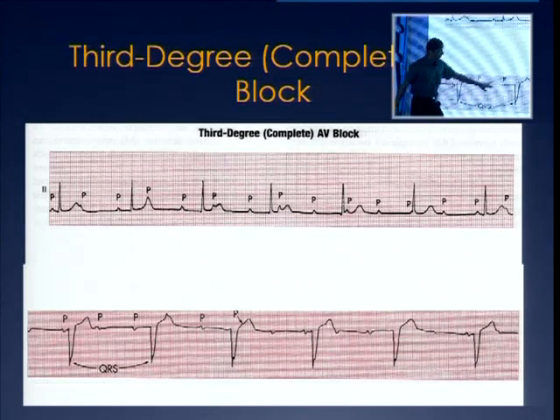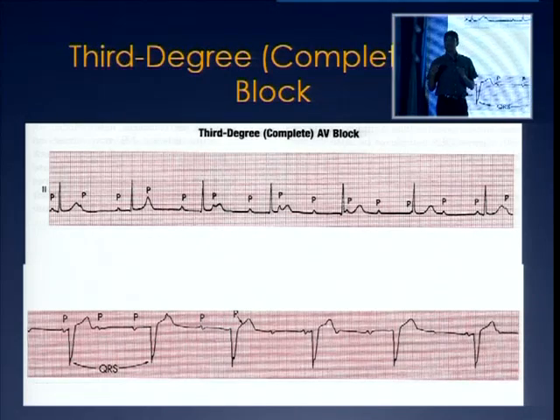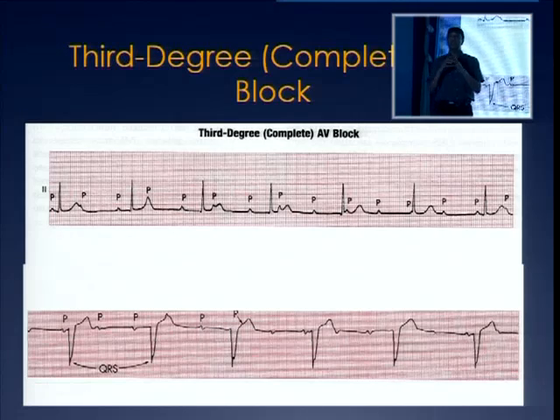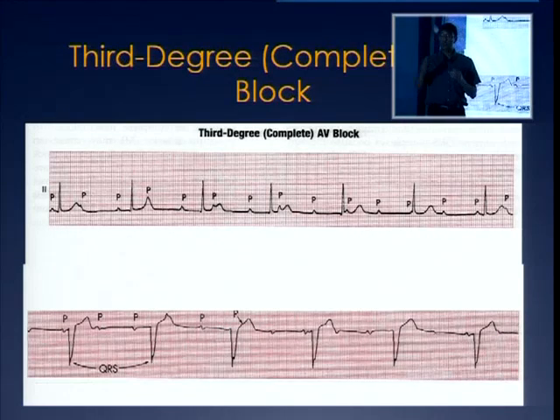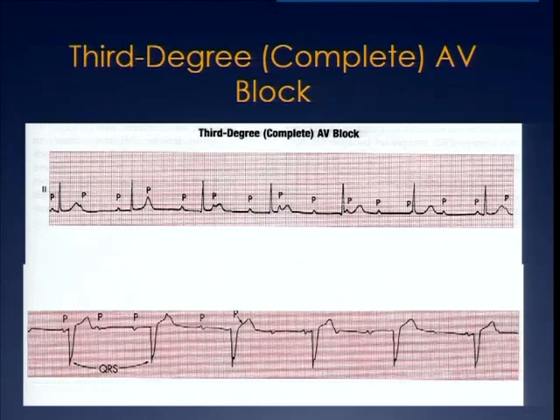So here, for example, you have a broad QRS. So let us say, for example, you have someone with a type 2, where without warning you get a drop beat. But in one situation you get a narrow QRS. That is nowhere near as bad as a situation where you have a broad QRS, because that implies that you have distal conduction system disease, and this patient may progress to a situation where he needs a pacemaker.